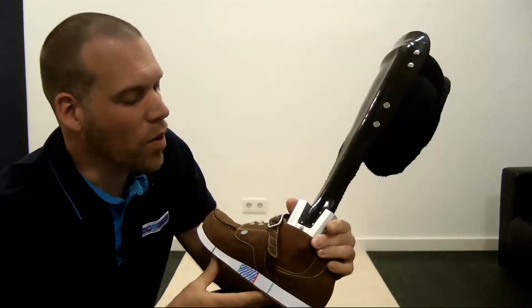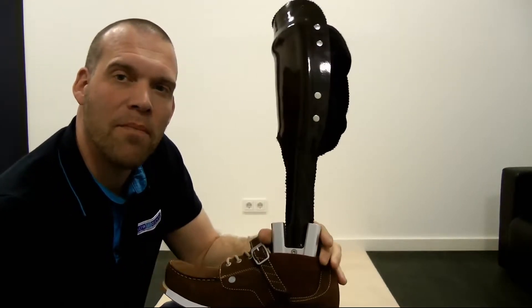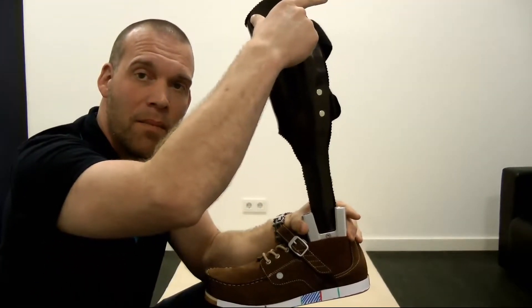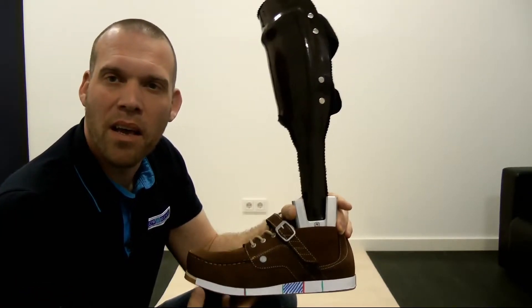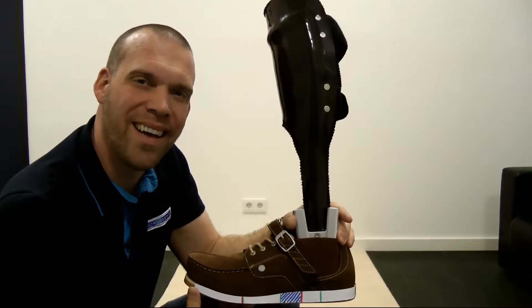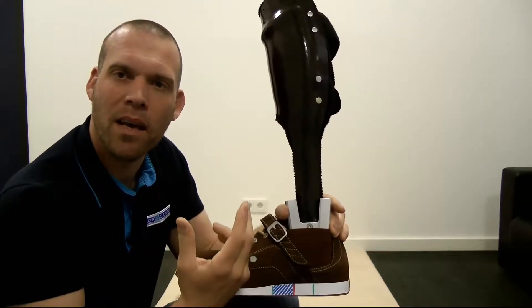How it works is explained in depth in the online tutorial. We described that the vertical plumb line from the center of gravity through the middle of the AP should fall in the front half of the supportive area. These are all very nice words, but what exactly do they mean? What is hidden in this terminology?